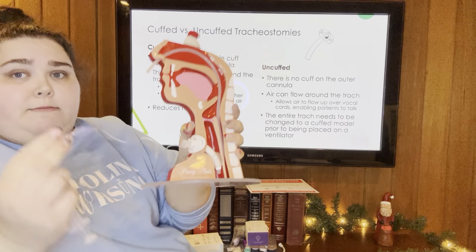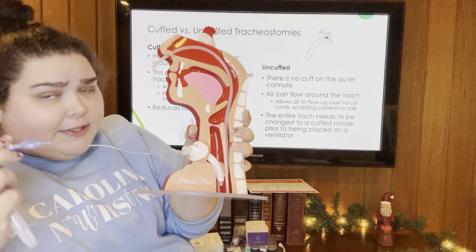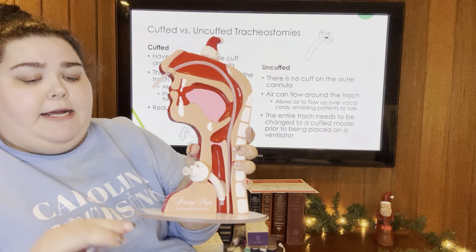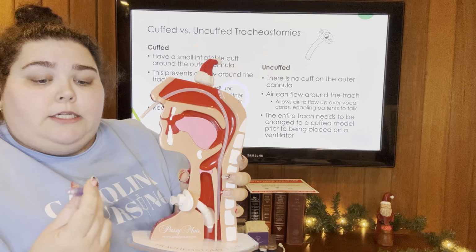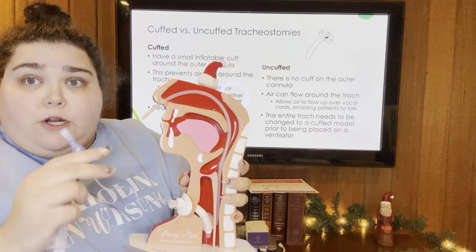So this is an important piece of the trach. This is sitting on the outside of Tom's body, so you'll see this on the chests of patients in the ICU and on the floors in the hospital. And so we can squeeze that, and you can see it's full, so that tells us that inside the body the trach is cuffed. So Tom here is ready to be put on the vent if we need to.